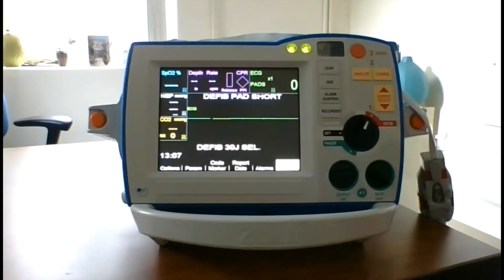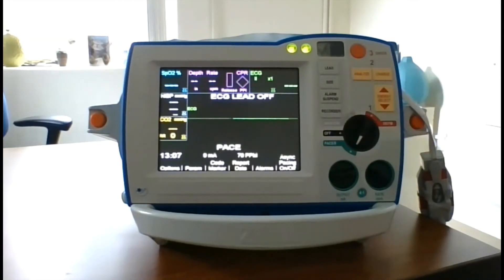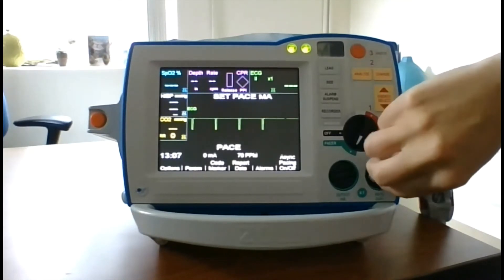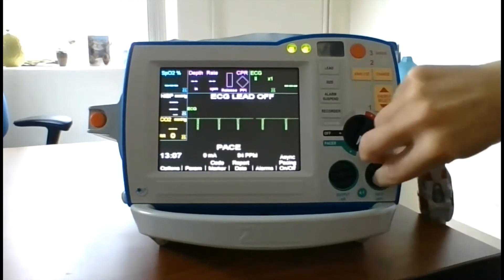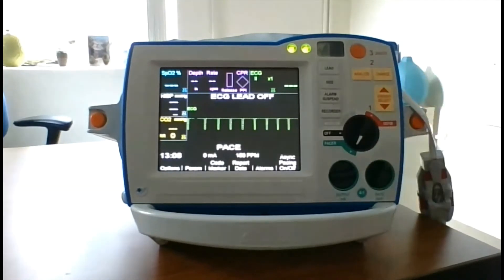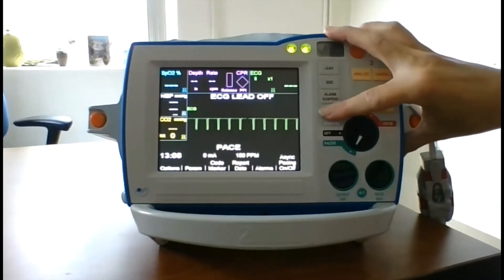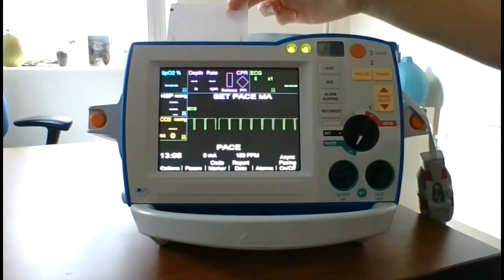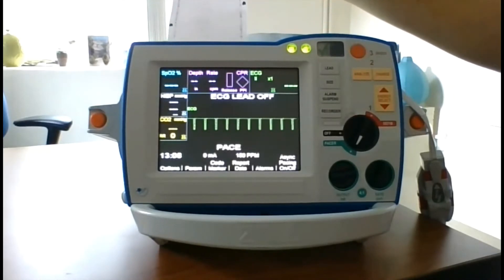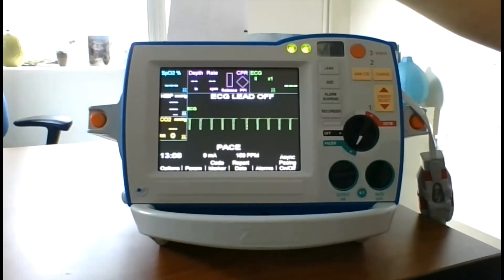Next, we'll perform the pacer test. Start by turning the dial to pacer. Turn the pace rate to 150 using the dial. Press the recorder button. On the strip chart, verify that pacing stimulus markers occur approximately every centimeter, which would be 10 small divisions or 2 large divisions.